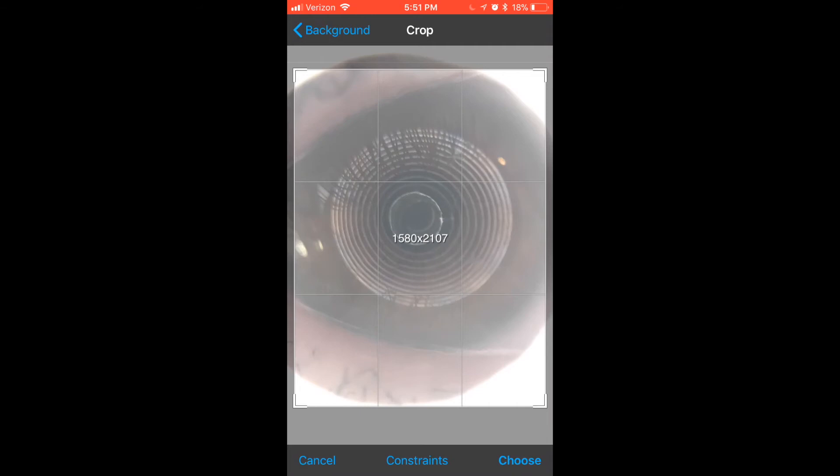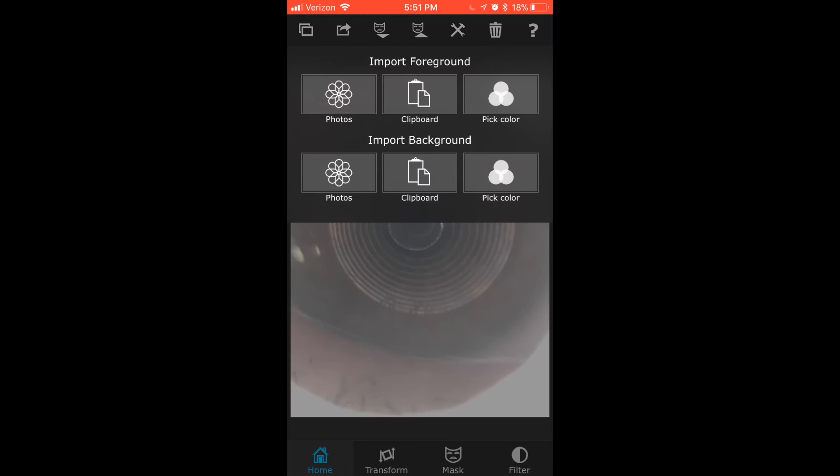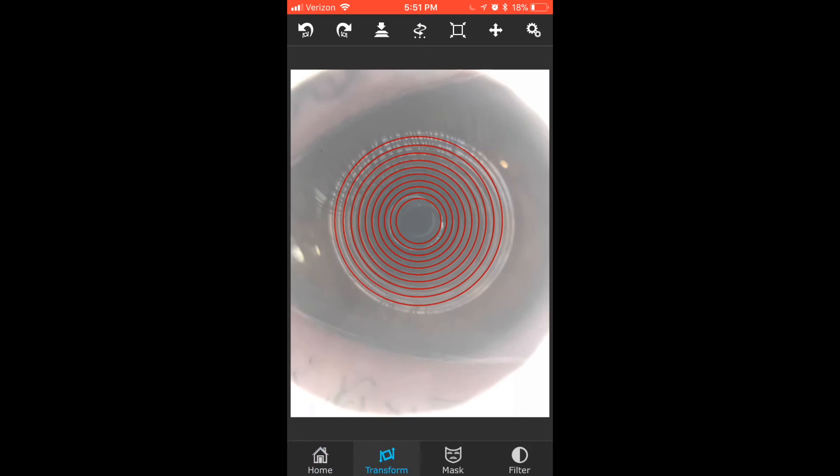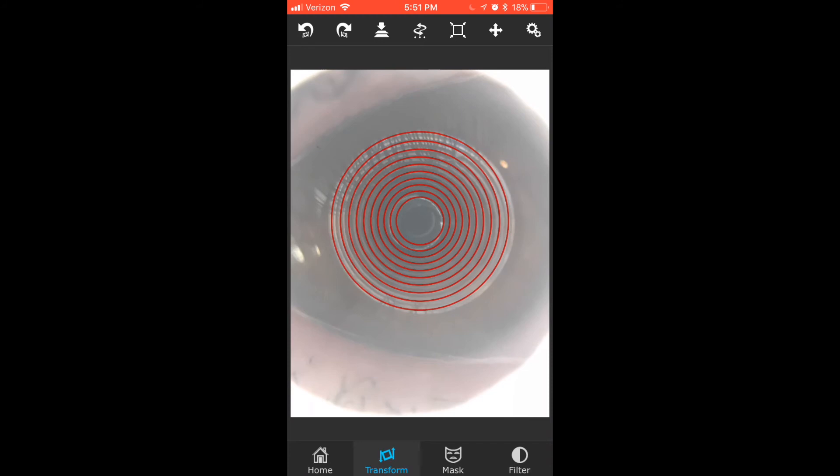So I crop down my image. From there, I'm going to go to the two boxes again. I'm going to go to Import Foreground, press Photos, and click on my red rings, which were emailed to you. Then I'm going to go to Transform, so I can move around these red rings. I'm going to line them up with the original white rings, and then from there, I will have my finished image.